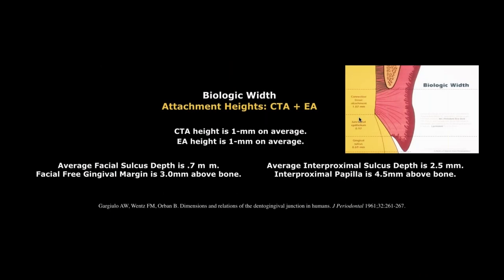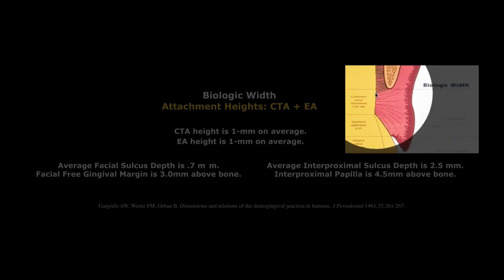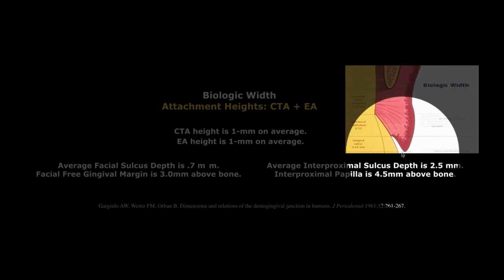I'll run through this a little quickly, but basically it's a simple process for us all to work through as we look at our cases. One, wherever the bone is, you will find tissue approximately 3 millimeters away. If the bone is not there, the tissue will not be there. So your job as a technician is to make sure that your contact is usually about 3 to 4 millimeters away from the bone. I'm going to say 4 millimeter contact point to be specific. I want a contact point that's exactly 4 millimeters away from the bone.